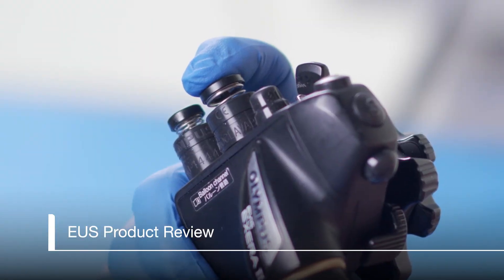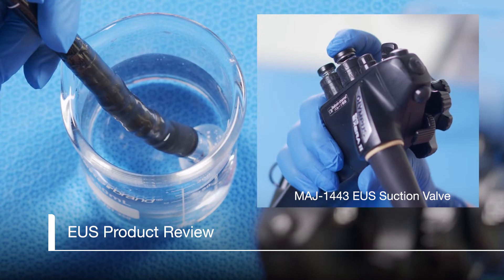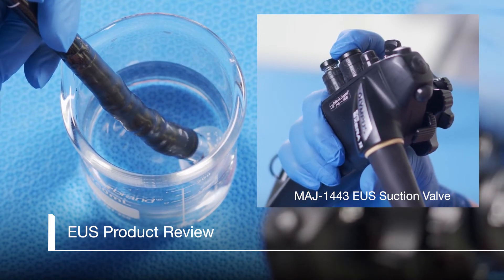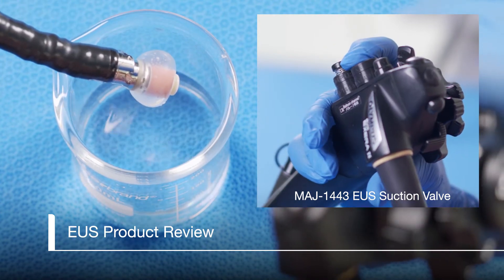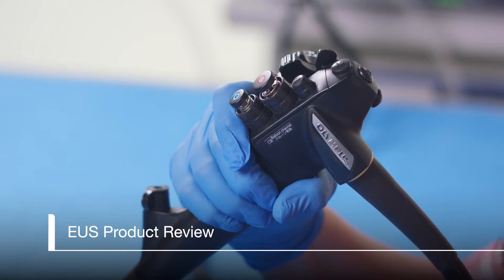First, let's review the MAJ1443 Suction Valve. Pressing halfway down to the first stage on the button of the MAJ1443 Suction Valve will aspirate fluid into the working channel of the scope, while completely pressing on the button to the second stage will aspirate the water out of the balloon.